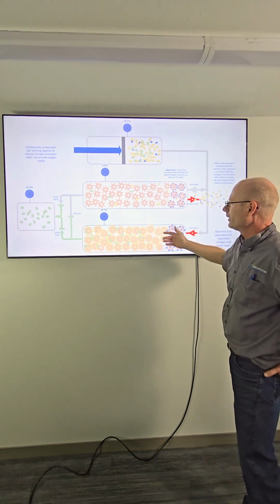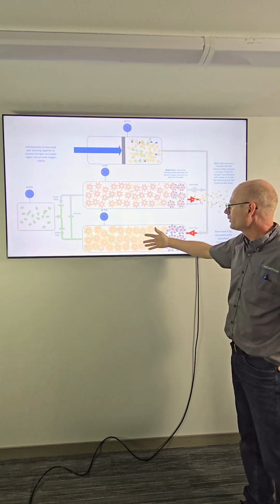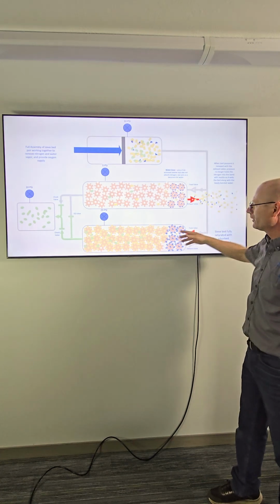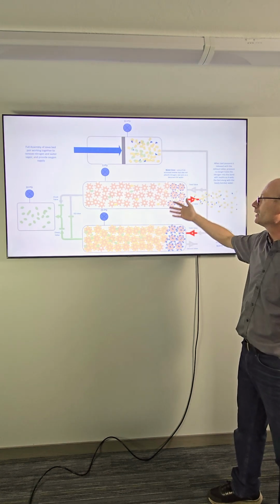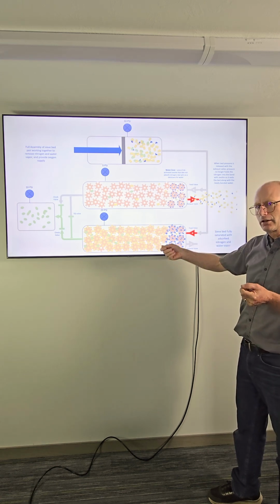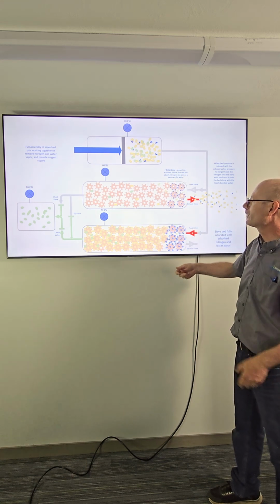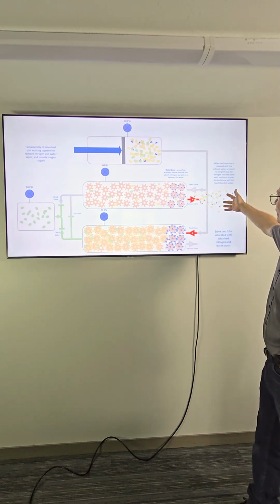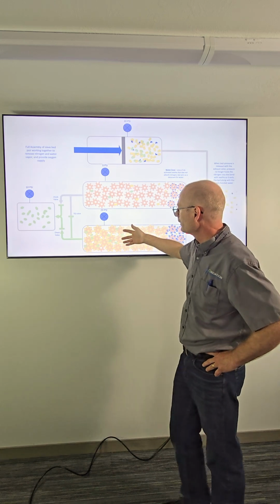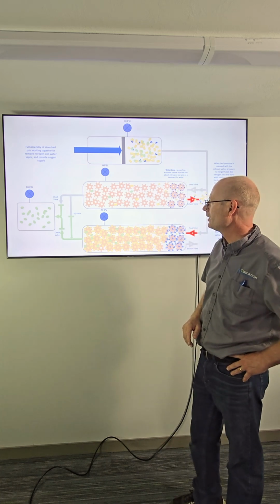So now we've got two of these sieve beds. And the beauty of having two sieve beds is when one is filling and we're ready to exhaust it, as this is exhausting, we can be filling the next one. So it's a continuous cycle. We don't have to start and stop. It would be like having your sieve with the sand, like a continuous operation. You'd have two of them going, so as that sand is pouring in, you can switch from one to the other. So as this one is exhausting this nitrogen and water vapor, the other one is filling back up again. And now we tie the two ends together so that oxygen can collect into our receiver tank.